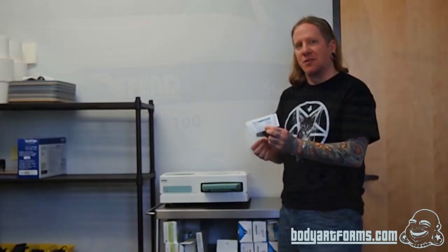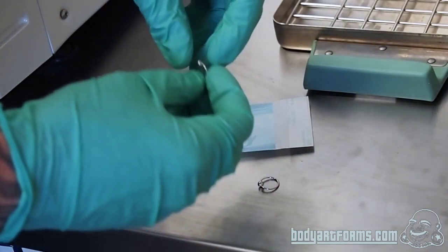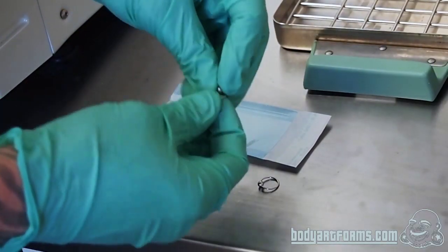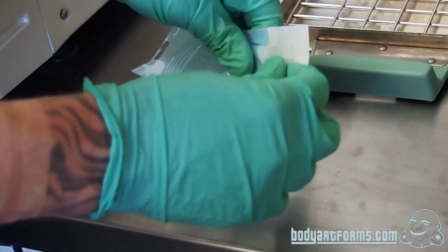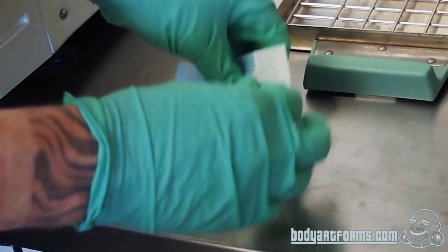All of your jewelry is going to come in one of these little sterilization pouches. Right here you can see on it that it says the Defend will turn purple when it's been steam sterilized. Right now, you can see it's a nice green color. All of the jewelry that gets sterilized will get packaged in one of these little sterilization pouches. The jewelry will be disassembled and inserted into the pouch, because if it's not disassembled, it can't be sterilized properly.